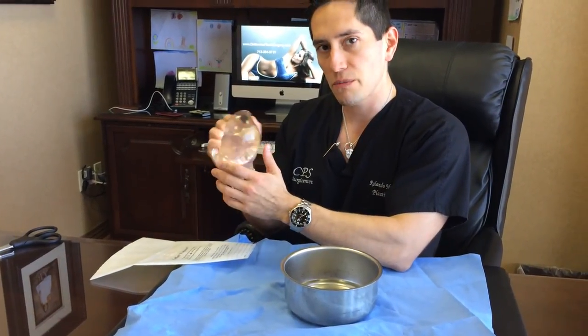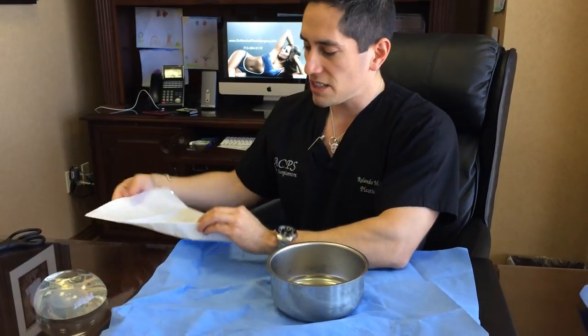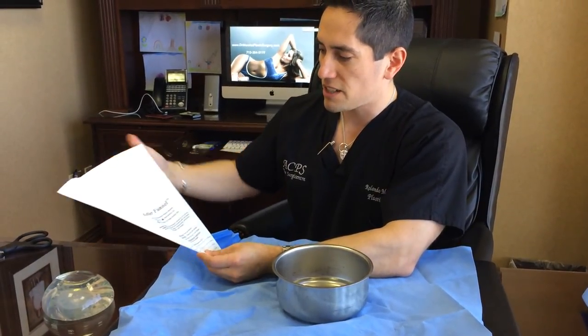Because silicone implants, remember, come pre-filled. They're sealed, and this is how it comes from the manufacturer. So you have to get this volume through small incisions. Well, that's what this device does. It helps us do that process.